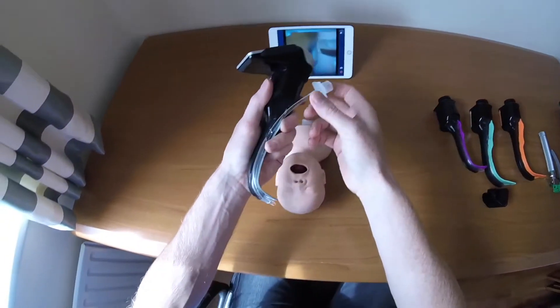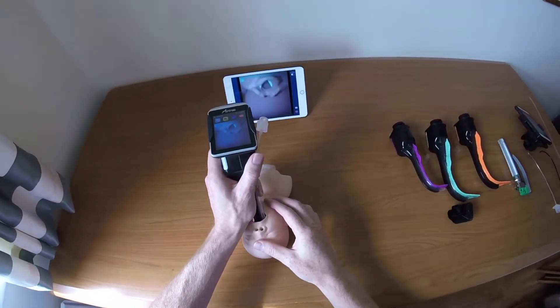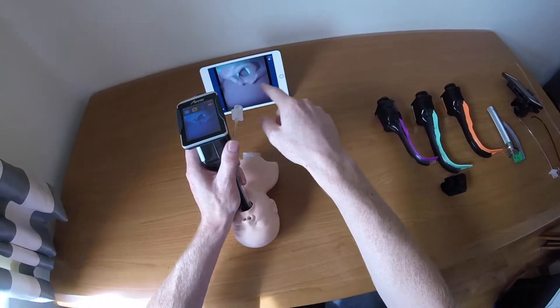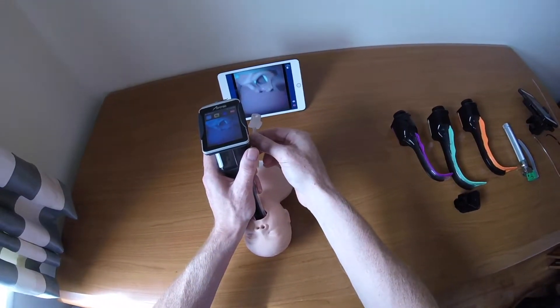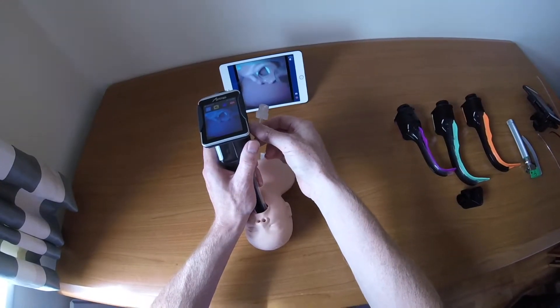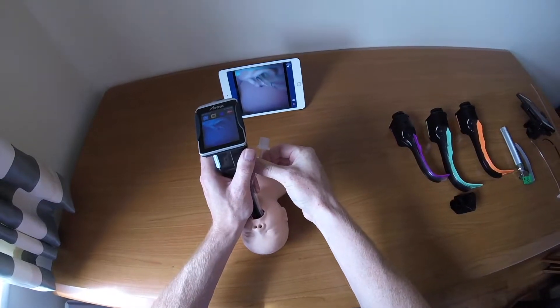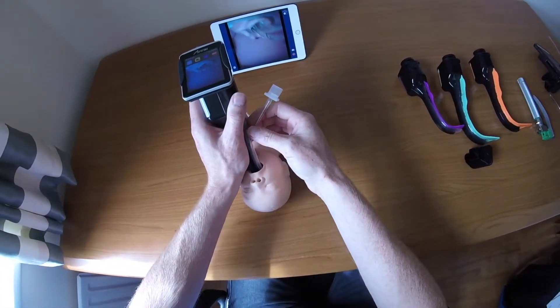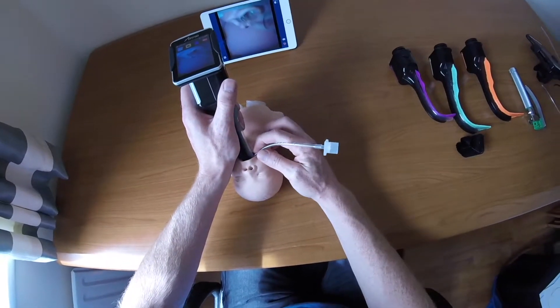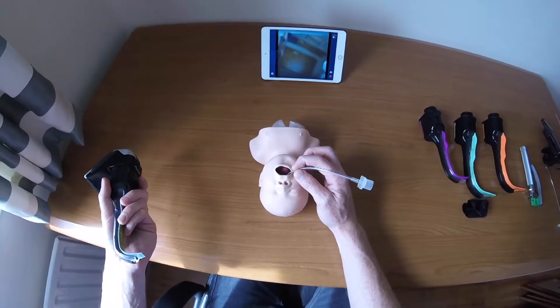In real time: insert the Airtrack into the middle of the mouth, ensuring you're far enough back so the view is in the top half of the screen, then advance. Make any adjustments needed — for example, go slightly left then rotate clockwise to bring it into the airway. Once intubation is done, pull the tube out of the channel to the side, hold it, and remove the Airtrack from the mouth.